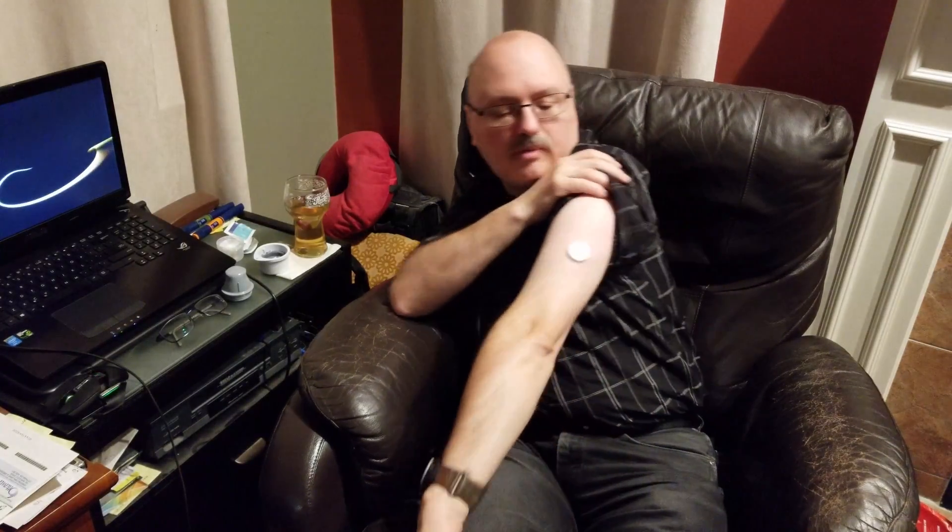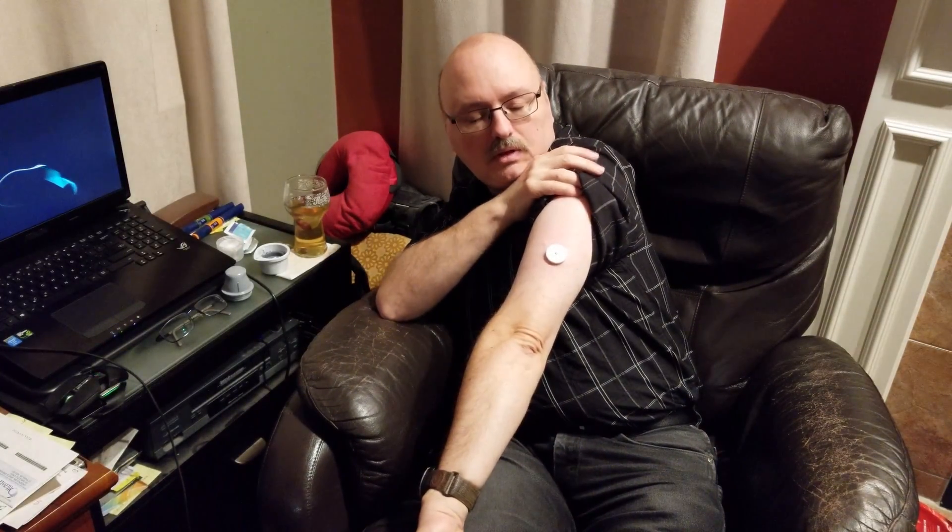I've noticed since I've been using it that the first hour, or even an hour and a bit after you first put it on, the readings aren't accurate — they're either too low or too high. That's why you still want to keep your manual method: prick your finger, put the needle on your finger, and test it the old way.